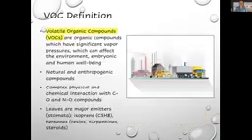Early findings and definitions, VOCs. What are VOCs? VOCs stands for volatile organic compounds. These are organic compounds which have significant vapor pressure and which can affect the environment and can affect the well-being of humans as well as gametes and embryos.